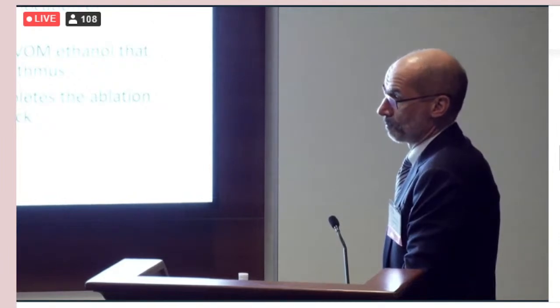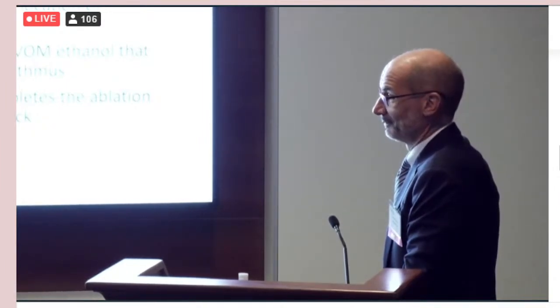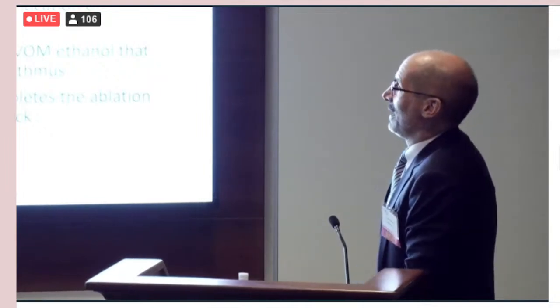So would you say, clinically, you have a lot of experience, but just taking this home, would you say reserve this for people who had a mitral isthmus line and couldn't get a block and then go do this?